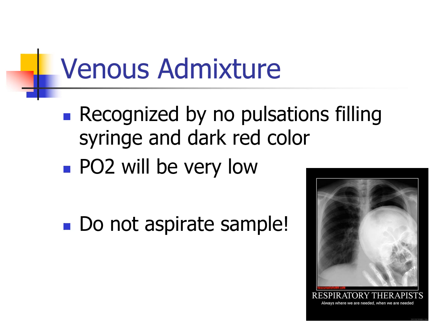So there are many RTs like, I got blood. And I'm like, yeah, it's venous, but we got blood, right? That is not a blood gas that you can use because it's from a peripheral vein. If you're going to do a venous blood gas, it needs to be from a central line, something that's very close to the vena cava, right? That's why central lines would be the ideal location here, and/or the distal tip of a Swan-Ganz catheter. But if you do not see pulsations, it's very dark, it does not flow really easily into the syringe, odds are you probably hit the vein and you're drawing a venous blood gas.